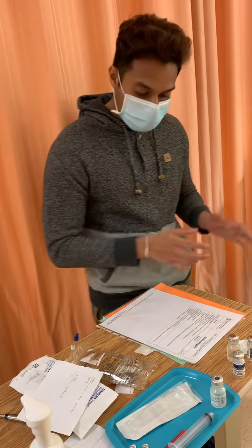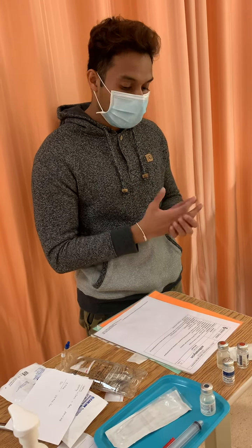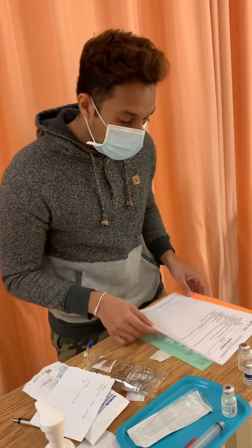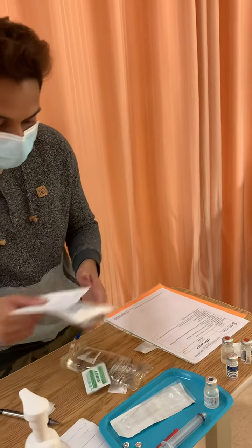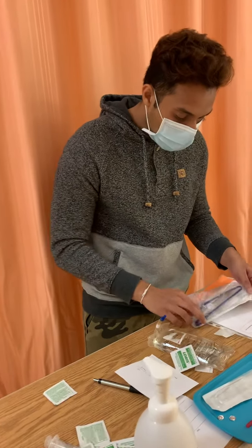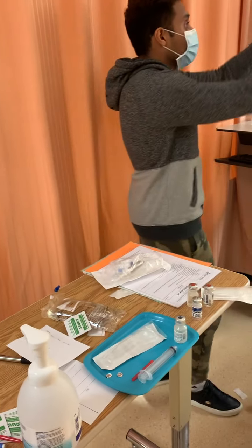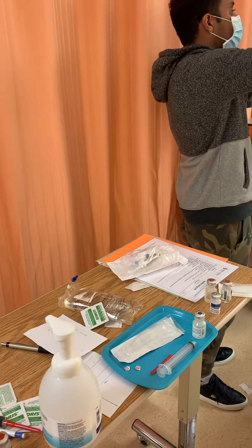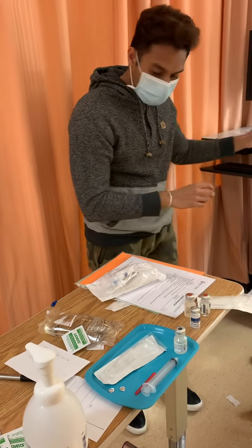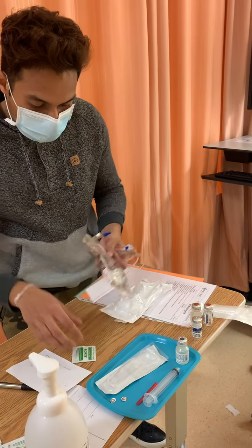And you have the right to refuse this medication, so the patient consented to receiving the medication. I'm just going to do some vital signs also before I give the medication, just to ensure that the patient's all good. Okay, so now we're just going to go forward and give the medication. The patient consented, so we wash our hands again and get our things out here. So grabbing our hook, we're hanging our primary below the mini bag. That's all good. And getting our tubing sets out and our mini bag. And we're getting our alcohol swab.